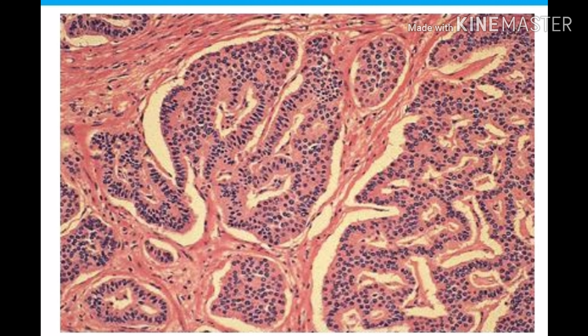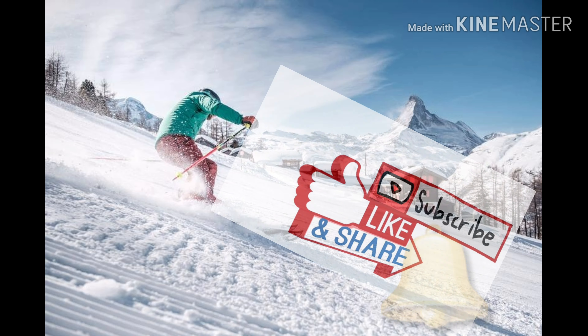In this case there will be a patient with features of carcinoid syndrome — the classical features are bronchospasm, flushing, diarrhea, or right-sided heart failure. You have to recognize this by the small blue cells which are neuroendocrine in origin, arranged in a rosette pattern. The site of biopsy is very important — it will usually be the small intestine or sometimes the lungs.